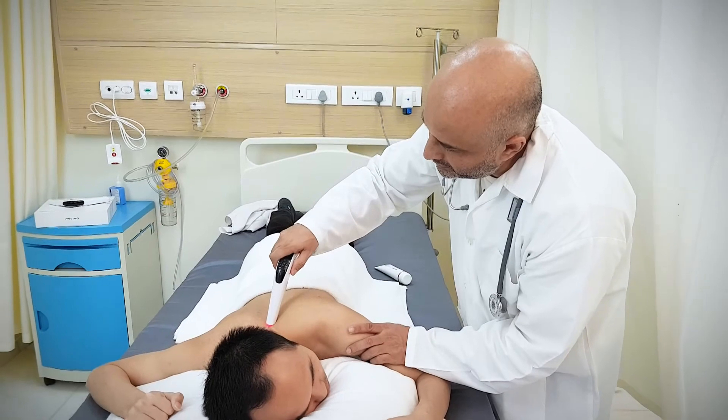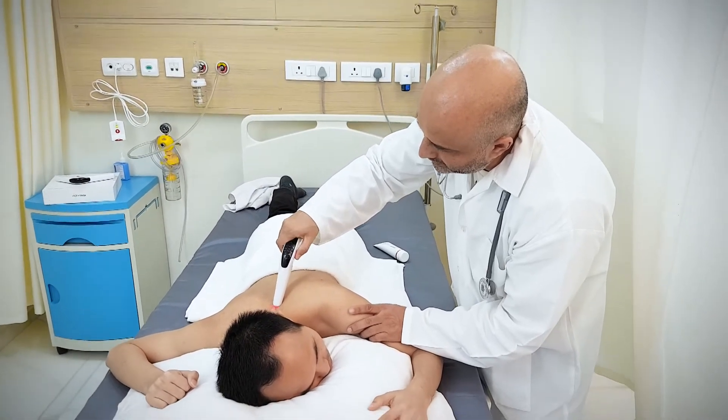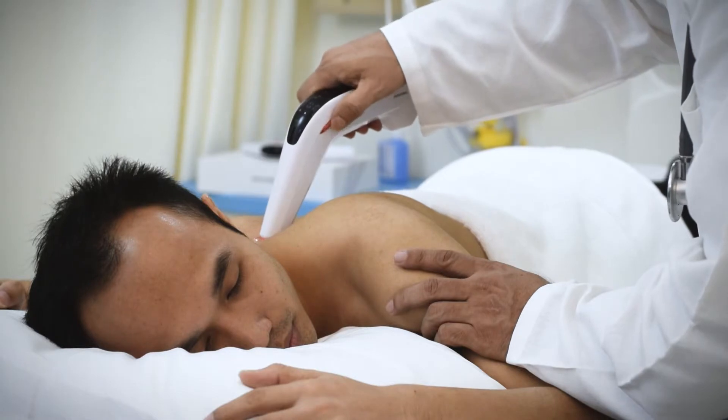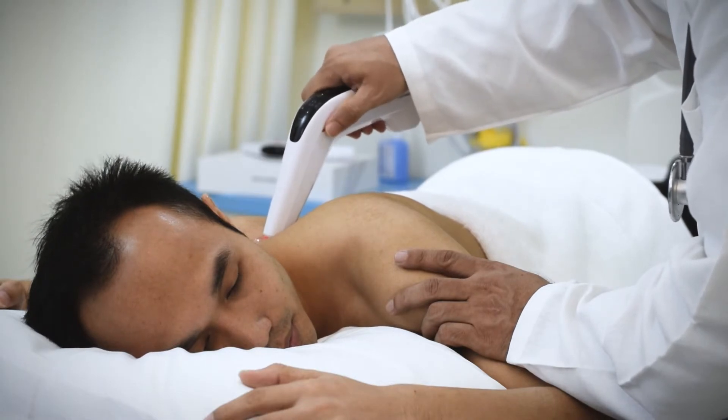Increase the intensity of the biostimulation until the patient feels a needling or prickling sensation. Do not keep the intensity too low or too high.